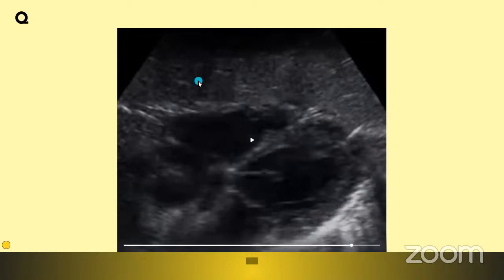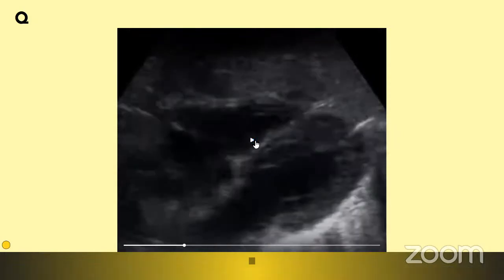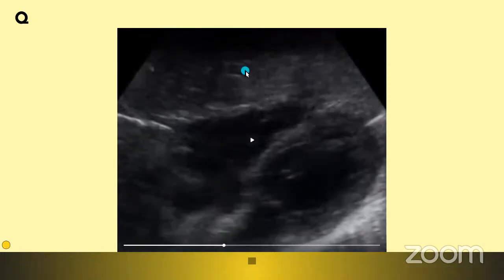So if you do a lot of practice with the ultrasound among normal volunteers or in patients with other pathologies other than the involved areas, you will get a lot of exposure regarding which is the density you would expect.